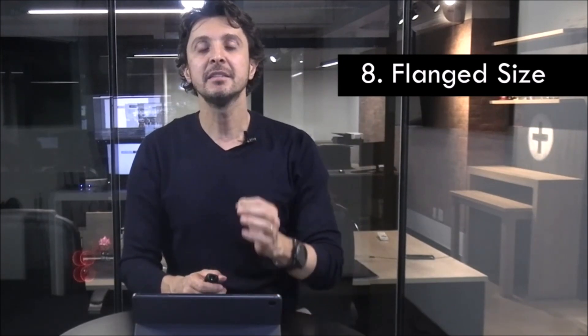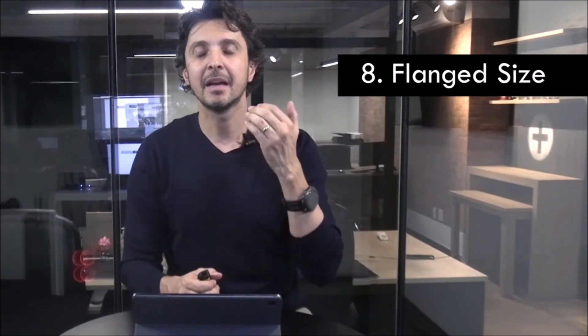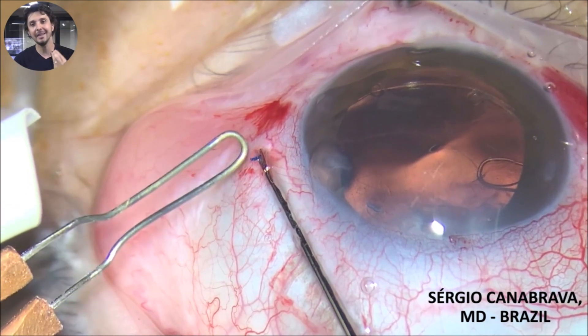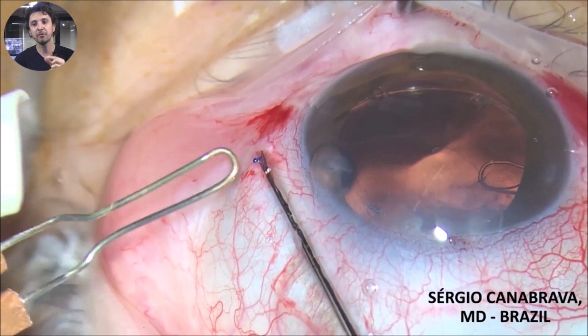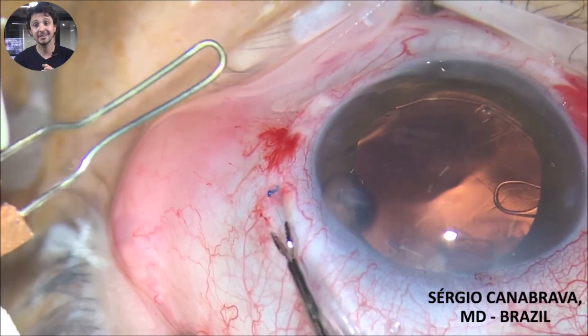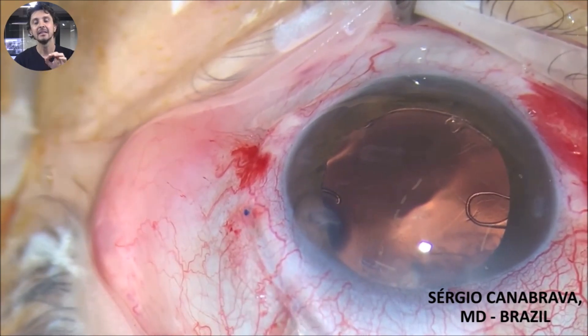Tip 8: flange size. This is an important tip because when surgeons start with the Karna Bravas technique they are afraid about the size of the flange going back into the eye. I show you in this video the size of the flange, but you need to have a long scleral tunnel, because if you have a small flange but go directly into the sclera the flange goes back into the eye. This flange size is perfect for inside the scleral tunnel.